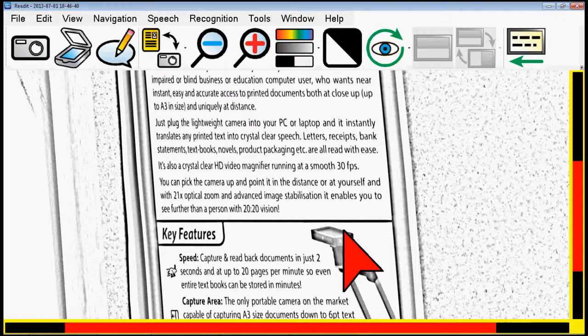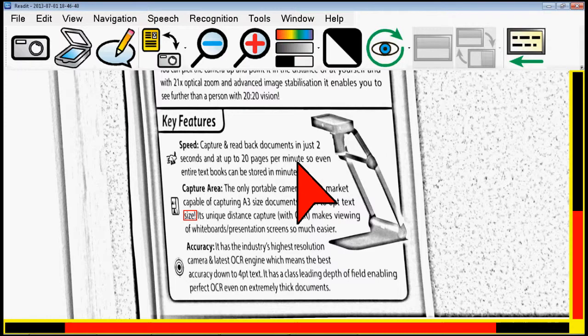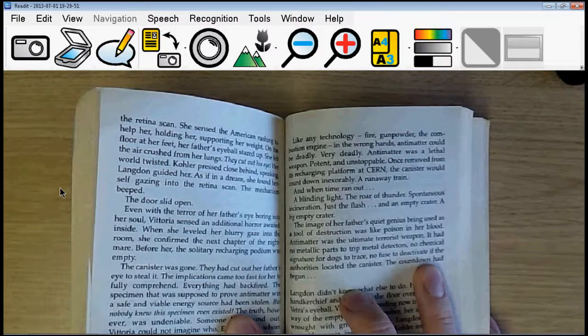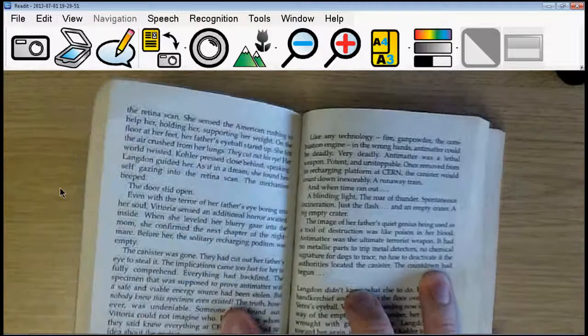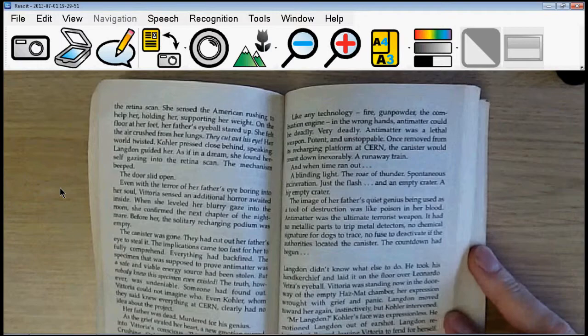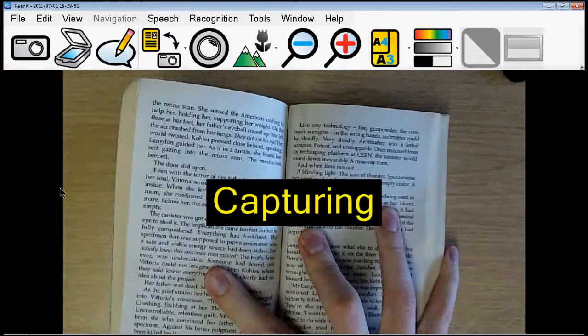That's the distance viewing section shown — I hope you enjoyed that. That's pretty much it, except for one more document in a second which will be a multi-lingual test. But just before I show the multi-lingual capabilities of the ReadIt software, I'm going to give a quick demonstration of capturing a book. So here we have a standard novel by Dan Brown. Normally if you wanted to capture, you'd hold the book down, initialise capture, and it would capture the page so you can read it. But I'm going to demonstrate some of the page straightening capabilities.